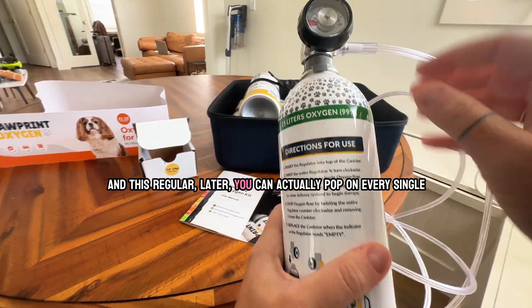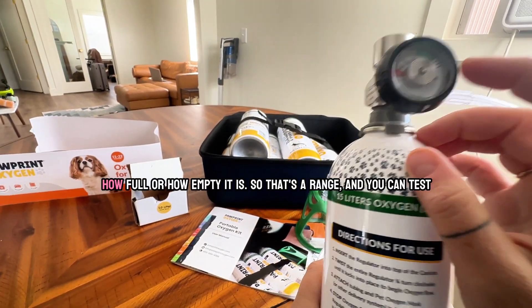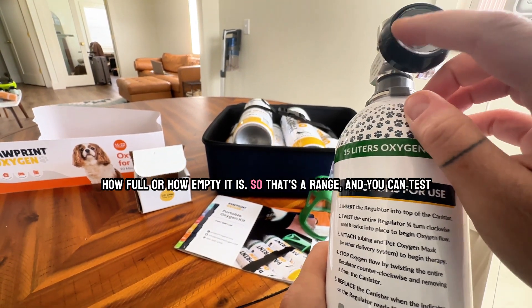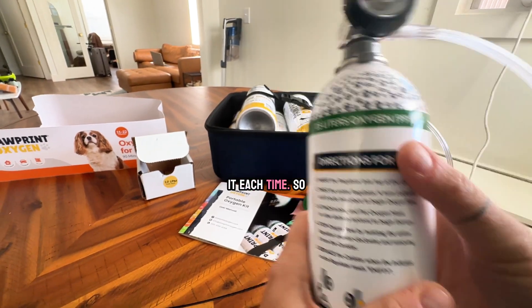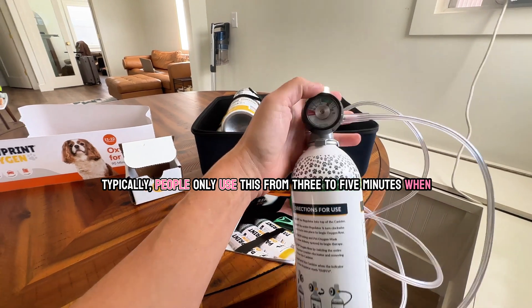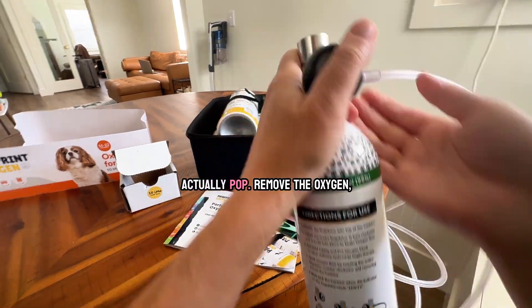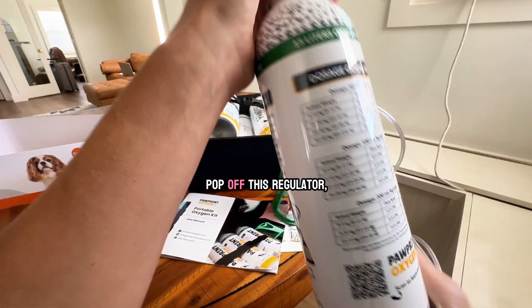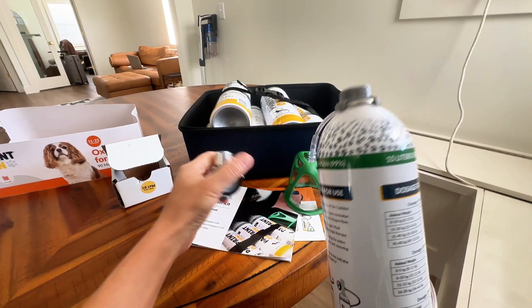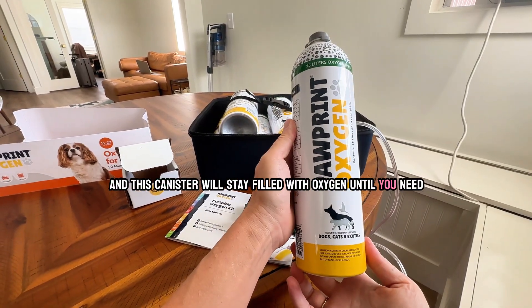This regulator can pop on every single canister and it'll tell you how full or how empty it is, so you can test it each time. Typically people only use this for three to five minutes when their pet is experiencing respiratory distress. You can remove the oxygen, pop off the regulator, and the canister will stay filled with oxygen until you need it.